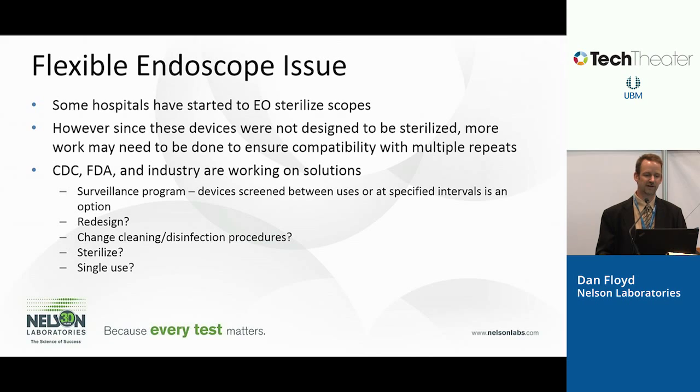So they're looking at trying to clean and find better ways to do this, or redesign the devices. Some hospitals have gone out on their own to sterilize these using ethylene oxide. Originally they're just designed to be disinfected in the hospital, not necessarily sterilized. But some hospitals, because of this, have gone to using ethylene oxide to sterilize them. So it'll be interesting to see if the industry follows suit and continues with that. But these devices weren't designed with ethylene oxide sterilization in mind.